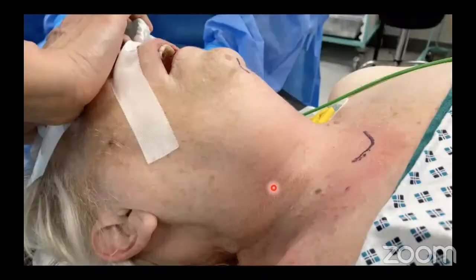So she was treated surgically, as you can see here. Please note that she was intubated nasally using a flexible fiber optic because she did have significant airway issues. No stridor, but impending airway compromise very, very soon. You can see here that she's having erythema in front of her neck within only a few hours.